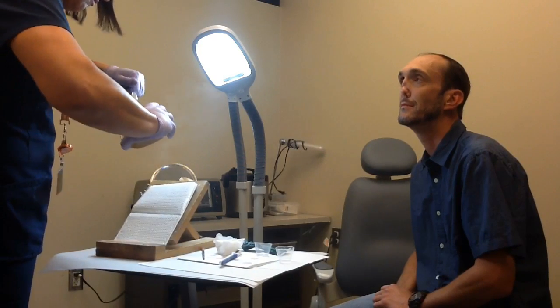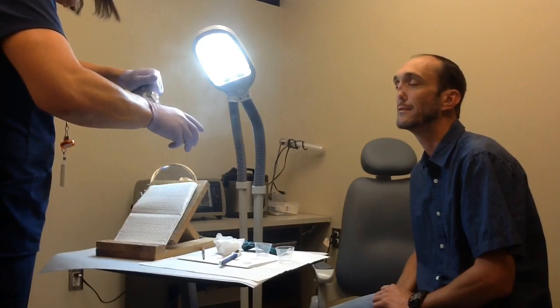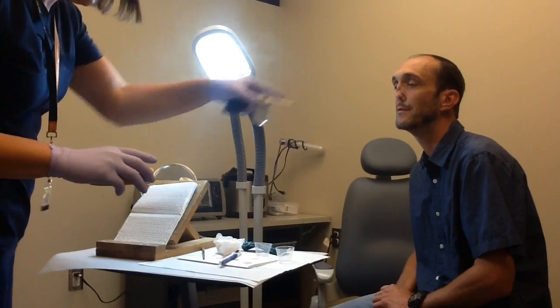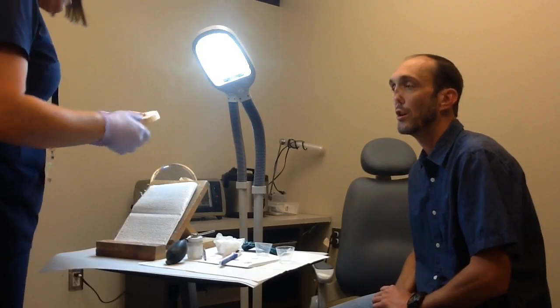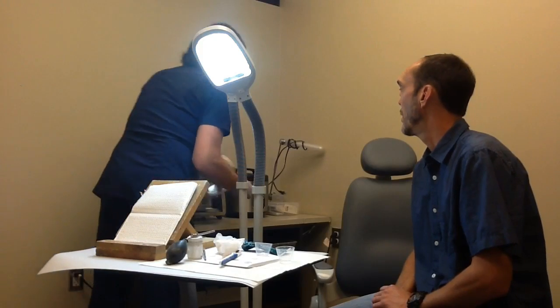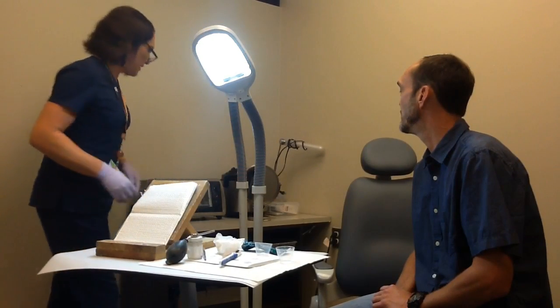Because that's really important. Because at the end of the day, if it's shiny, it'll look artificial, right? Sometimes I add a little bit of shine depending on where — like I might make a little on the edge of your nose because that looks kind of alive, you know? So we can do that after. Making sure we got most of the shine away. So this takes about 10 minutes, y'all. Here we go.